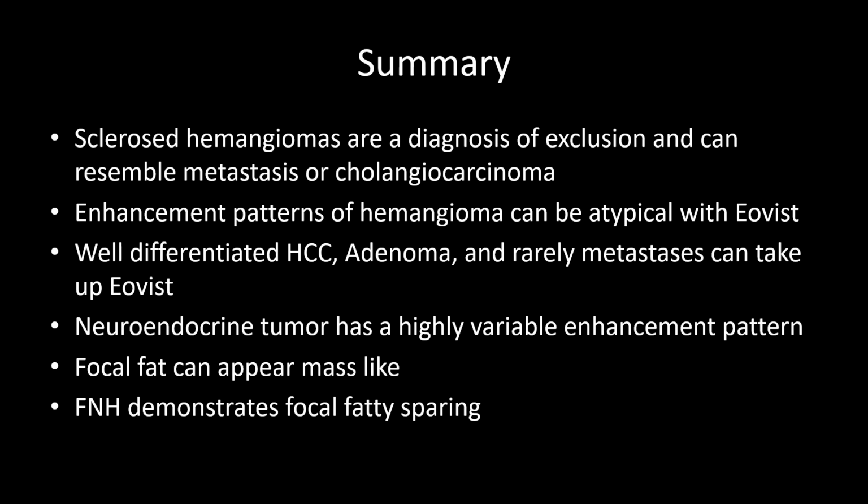I know this was a little bit of a hodgepodge of different atypical presentations and exceptions to the rules that we learned in the first two podcasts, but I hope that these different examples are illustrative of the pitfalls you can encounter when imaging the liver, and I hope you find them helpful.